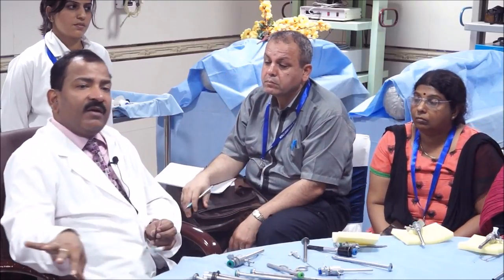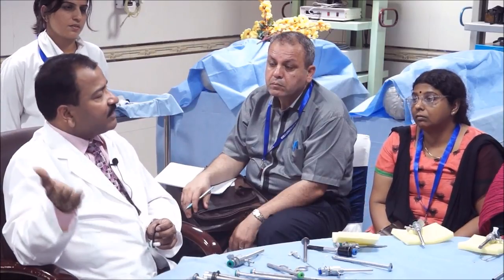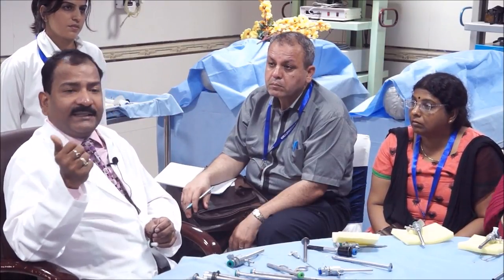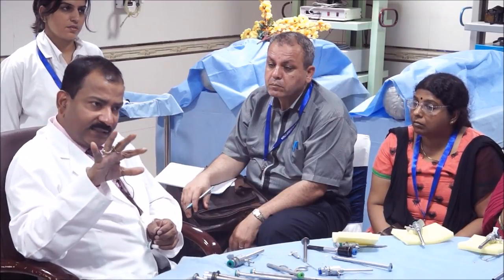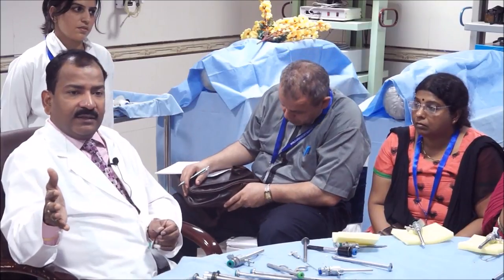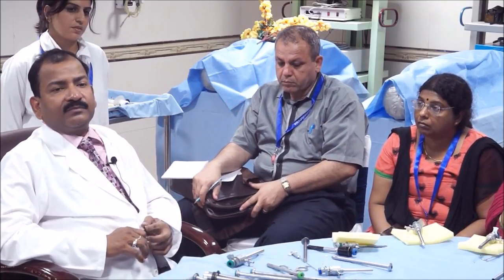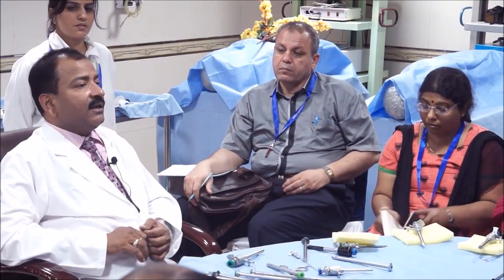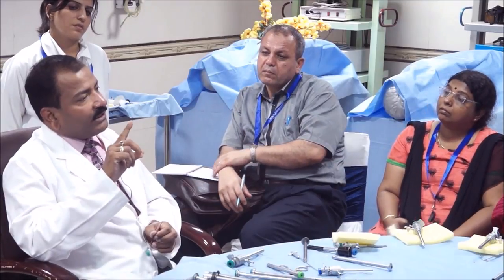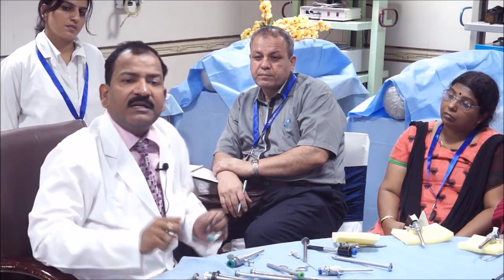You cannot sweep the bowel away. You cannot lift the tube. You cannot see the posterior wall of the ovary. Sometimes you even cannot see the appendix, because the appendix is hidden by the small bowel. So for diagnostic laparoscopy, 2 ports are required. For operative, at least 3. Do you know, even in single incision laparoscopic surgery, the incision is 1, but the ports are 3. So 3 ports are required, one for the left hand, another for the right hand.